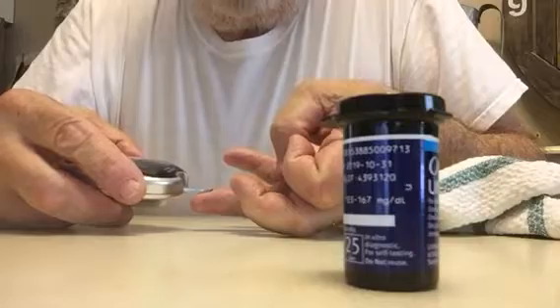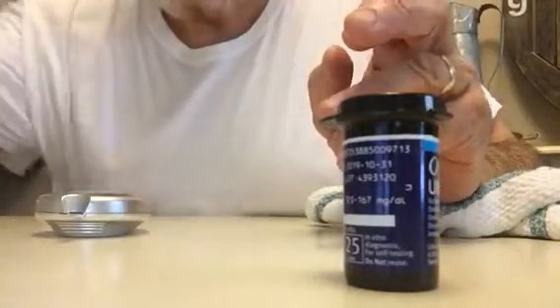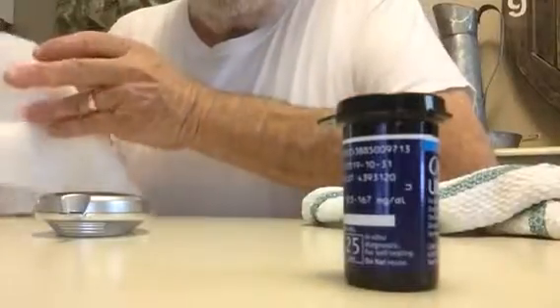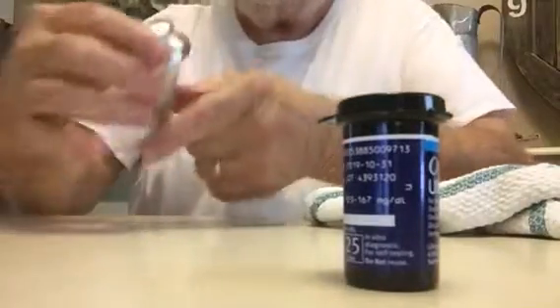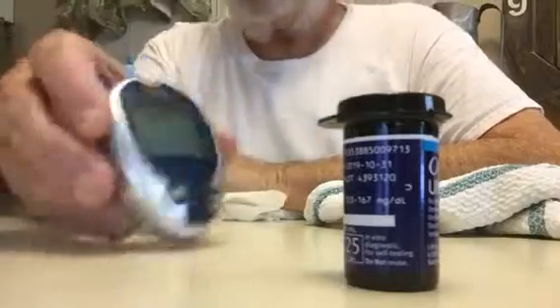I run that little dot of blood right up to the strip — three, two, one — and there we go: one seventeen. That's a good reading. It's all backwards on the screen, but simple as that.